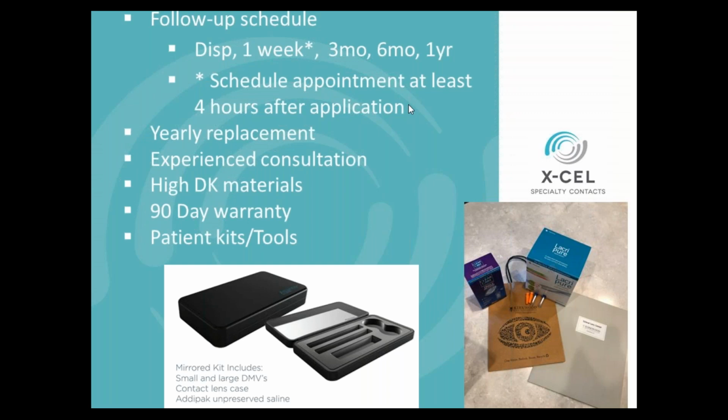And on that follow-up, or that 1 week follow-up, you're going through your steps again. What's my clearance centrally? What is it limbally? How does my edge look? Then you're asking the patient the obvious questions. How long are you wearing the lens throughout the day? What's your visual acuity throughout the day? How is your comfort throughout the day? And then observing them again, putting the lens on, taking the lens off, looking at that lens and that cornea without a lens on that follow-up, and then seeing if the patient is compliant.